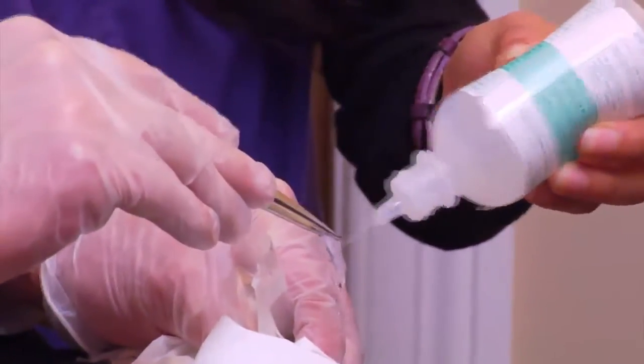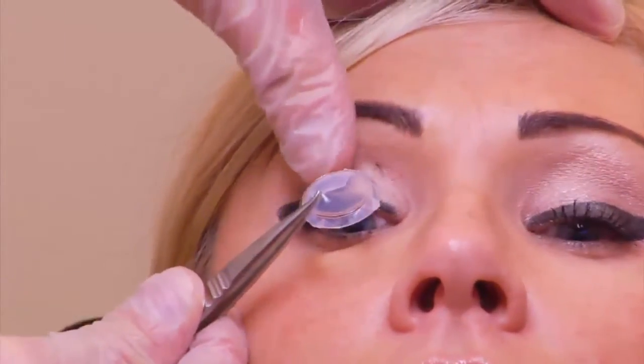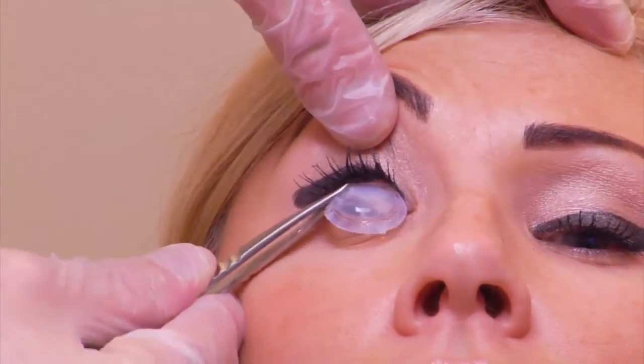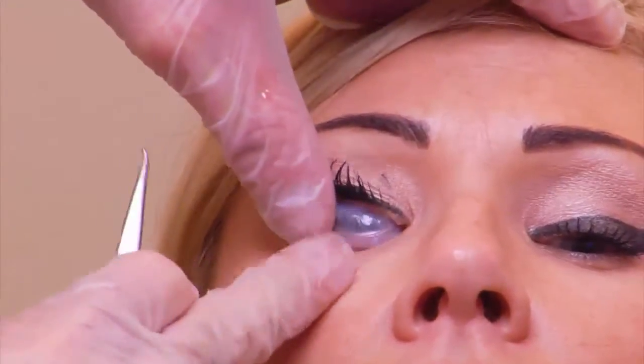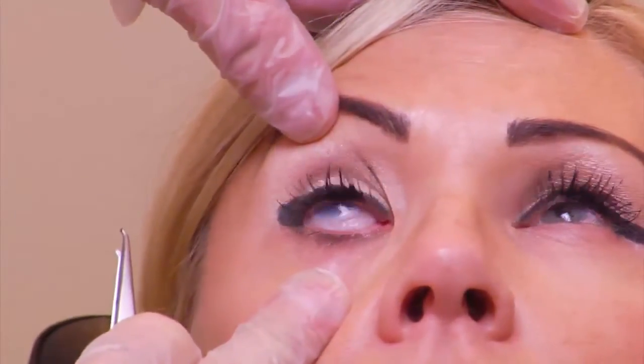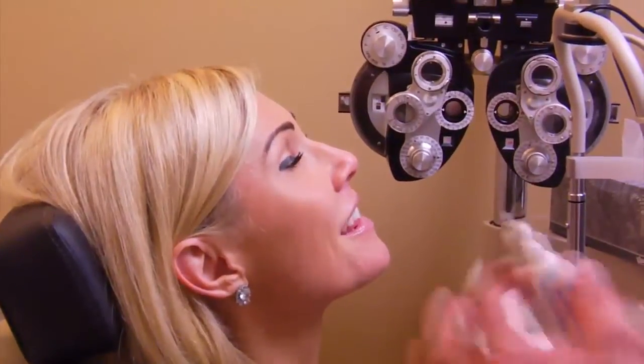Procara can be easily inserted in your doctor's office. To insert Procara, your doctor will hold the upper eyelid and ask you to look down. While you are looking down, your doctor will slide the Procara under your upper eyelid and then under your lower lid. This process is similar to inserting a contact lens. Once Procara is applied, your doctor may administer appropriate medications in order to maximize the healing process.